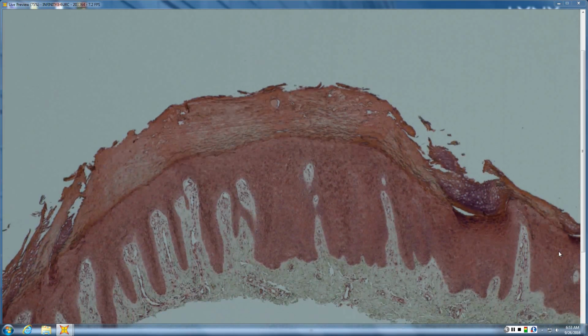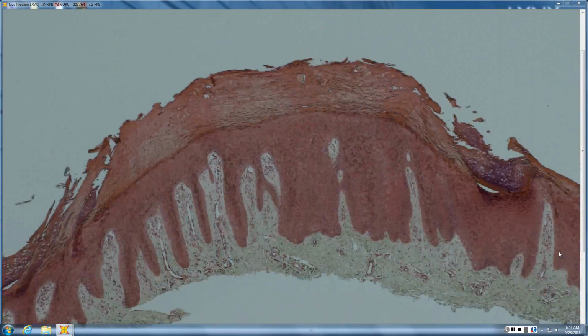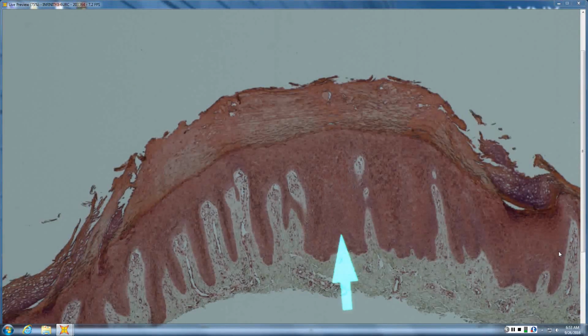However, there's some very important differences. So certainly you get acanthosis, and it can be very regular. And overlying that, you've got a pretty pronounced area of parakeratosis. It's orthokeratosis elsewhere, kind of around the periphery, but a lot of this is confluent parakeratosis. So you may be tempted to say, oh, it's probably just psoriasis. But if you look down in there, there's really absolutely no neutrophils. That would be very odd and make psoriasis much less likely. So really you just have confluent parakeratosis and then a fairly regular acanthosis, but no infiltrate, no neutrophils.